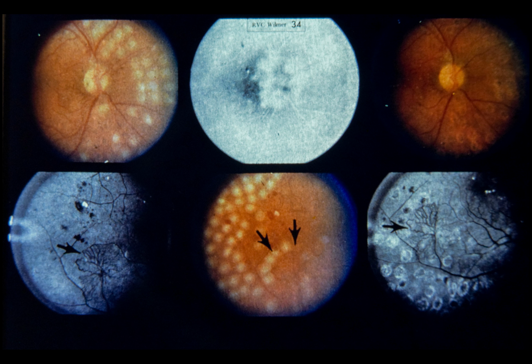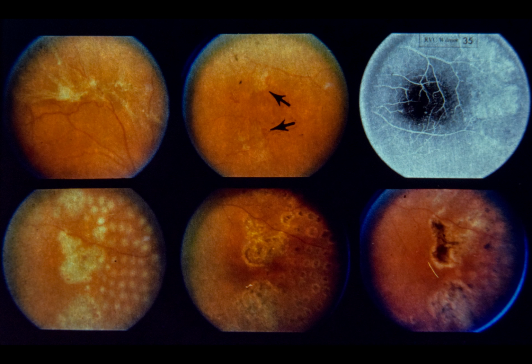Slide 35. Focal argon laser photocoagulation for retinal neovascularization. This 51-year-old white male had proliferative diabetic retinopathy in both eyes. In the right eye, epiretinal membranes and fibrous tissue, upper left, precluded focal argon laser photocoagulation. Upper center, note retinal neovascularization temporal to the fovea, left eye. Upper right, note early dye leakage from retinal neovascularization and marked non-perfusion distal to neovascularization.